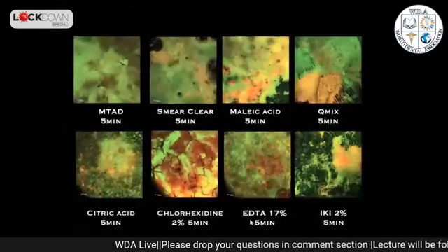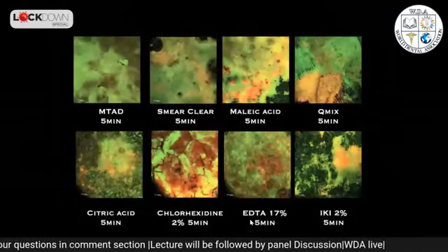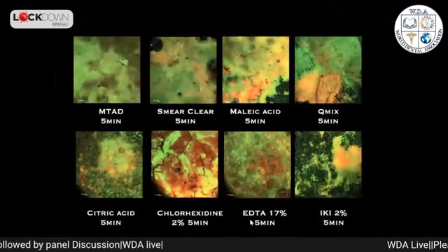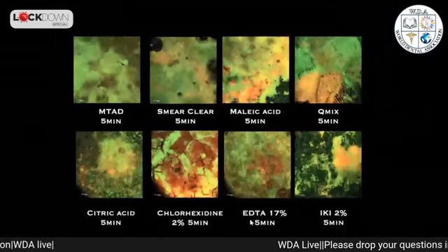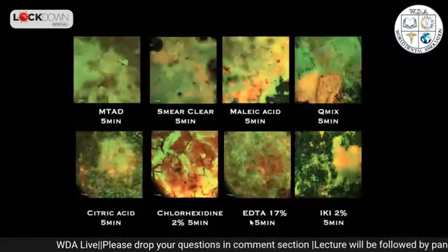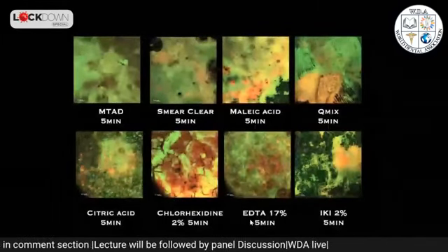And then you can see what was the result of the direct contact test of the irrigant solution with all these different commercial compounds. It was basically a very limited antimicrobial activity from this point of view.